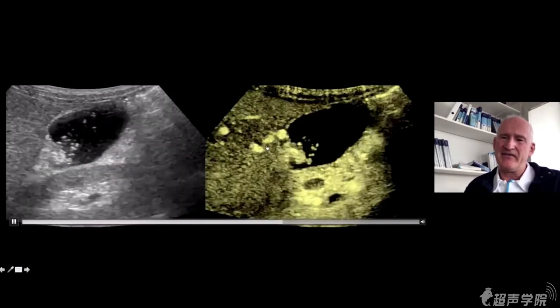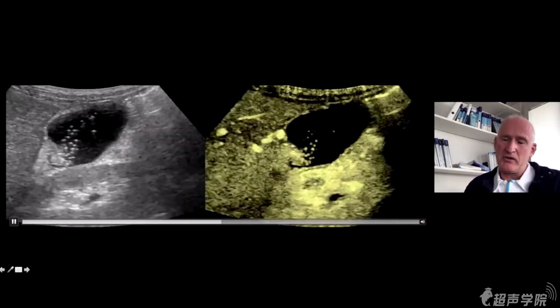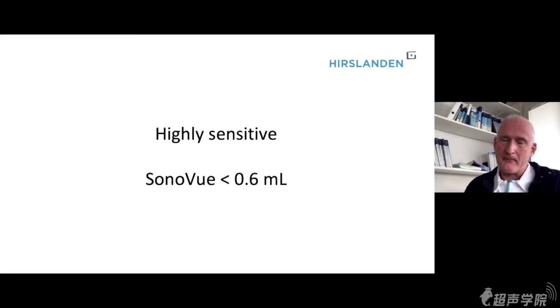And it's a didactic video. We might later on discuss what can be seen here. First of all, new equipments are highly sensitive. With some equipments, we have to use 1/10 of the vial.